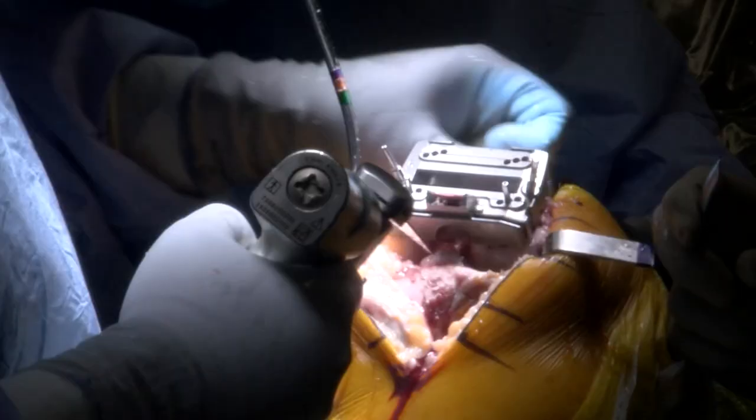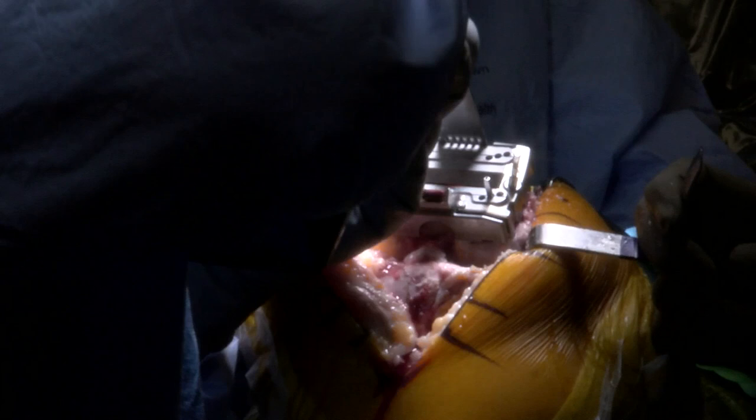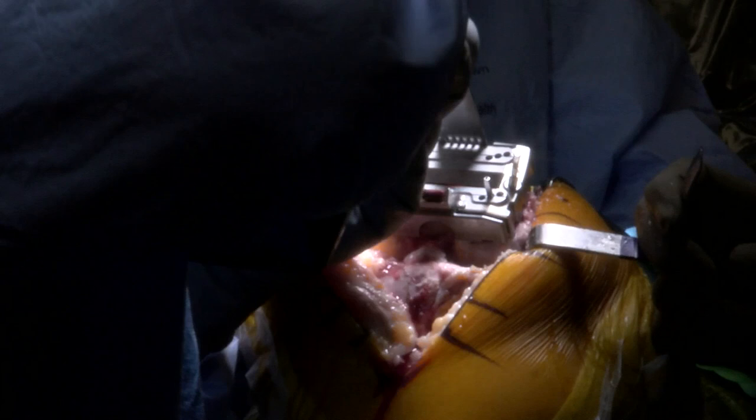These are the bony cuts that we're going to begin to prepare the shape of the end of the femur so the implant fits it.